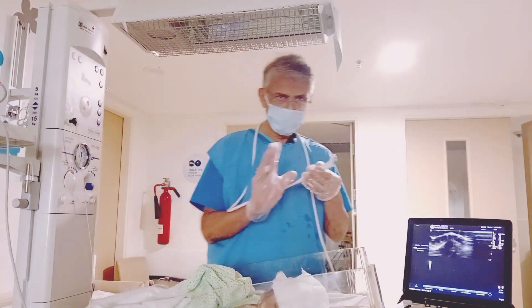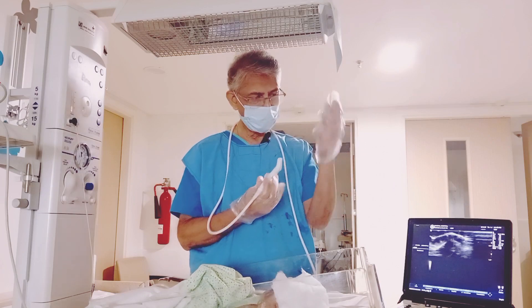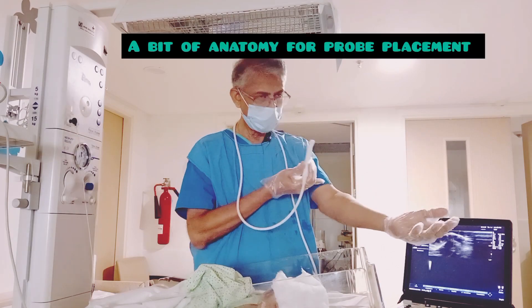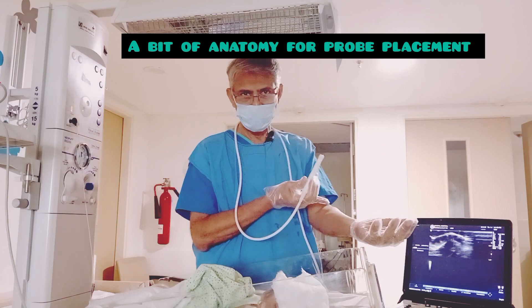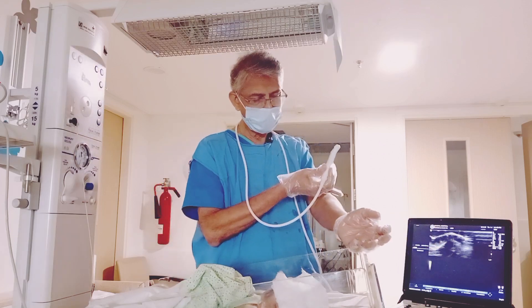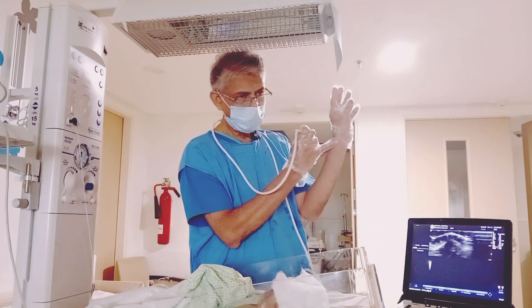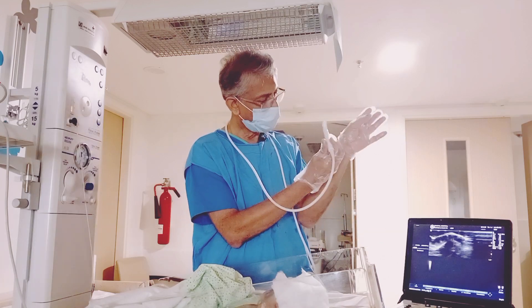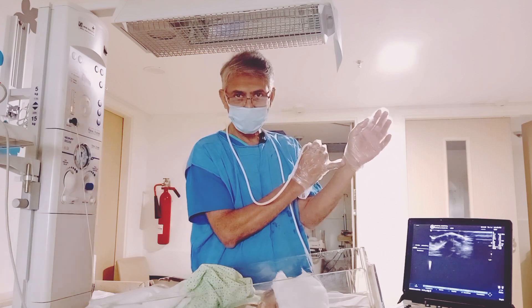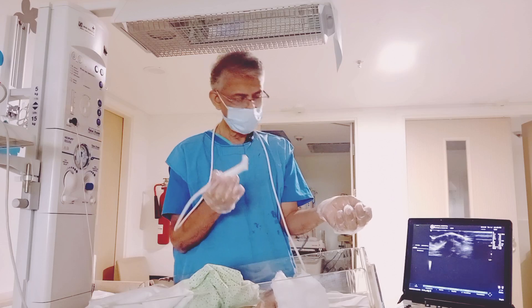Just to give you the background: the radial artery — this is the palm. You know the styloid process. The brachial artery bifurcates into radial and ulnar; the radial artery will run on the radial side, just above the styloid process — what we call the anatomical snuff box. That is where exactly the radial artery runs.